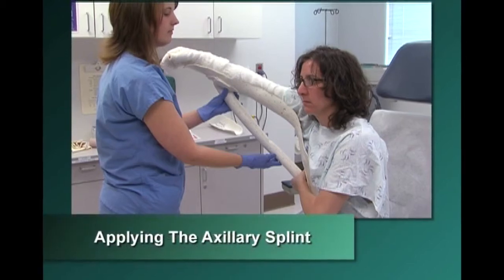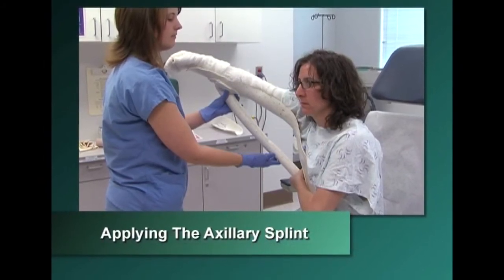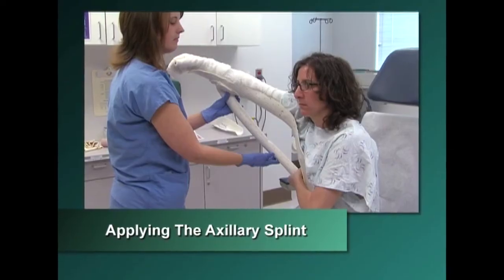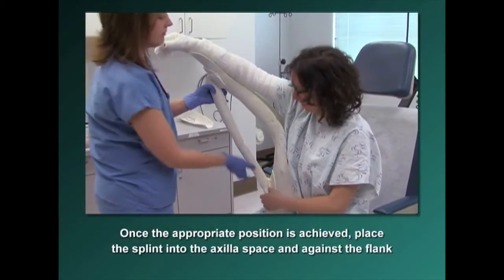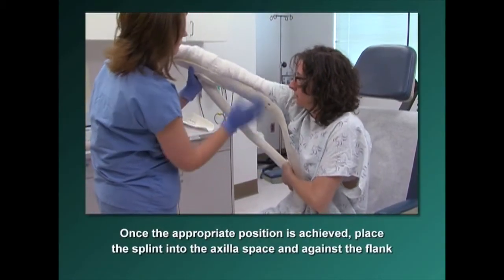To apply the splint, the patient may require assistance to achieve the appropriate position for placement of the axilla splint, especially if he is having pain or stiffness in the joint. Once the appropriate position is achieved, place the splint into the axilla space and against the flank.